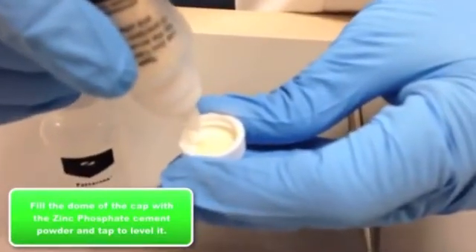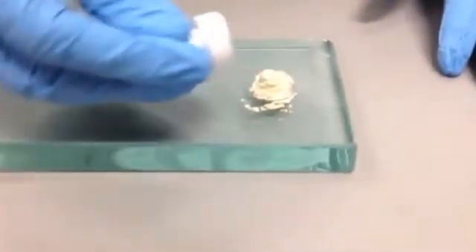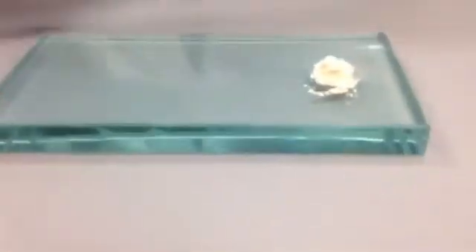So the first step is to fill the cap up to the dome line with powder and she's just tapping down to level it out. And then as soon as you get that, you pour it onto the glass slab that's been chilled.